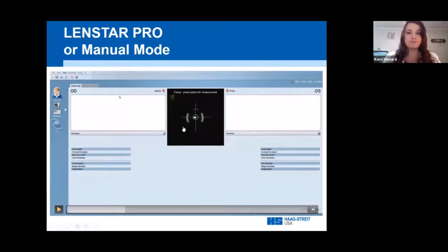That is your first goal in the manual mode: identify these clear parentheses, and then you're going to start to see these arrows. And these arrows will help you refine the distance away from the eye. Now the little arrow up top says go closer towards your patient, and a larger arrow on the bottom, like this one here, says come back.